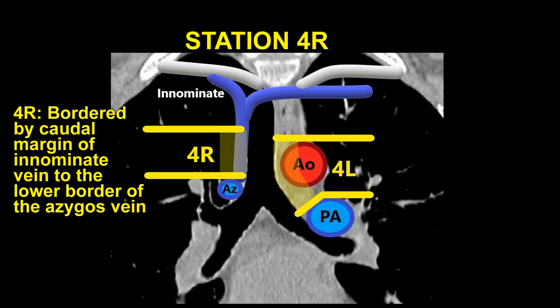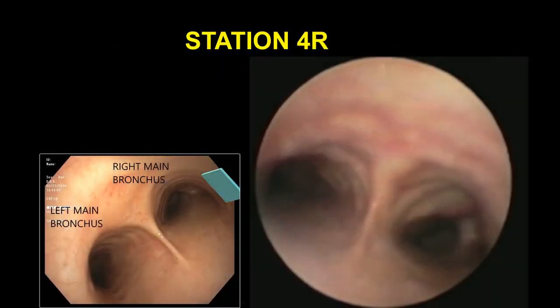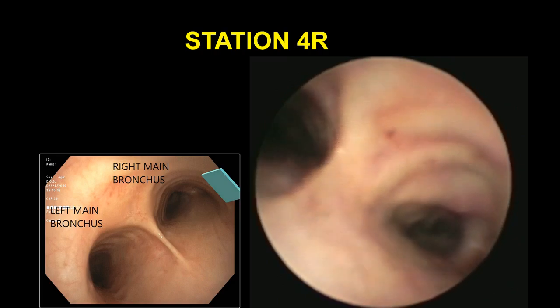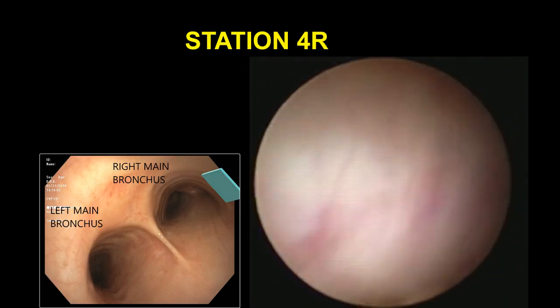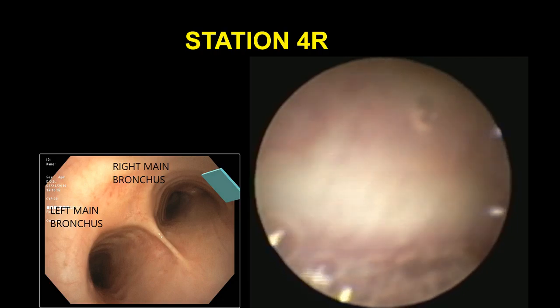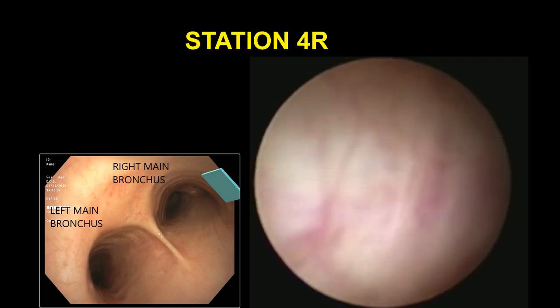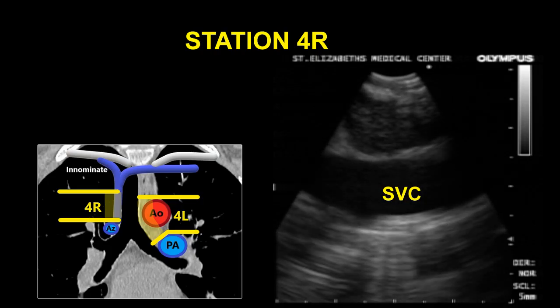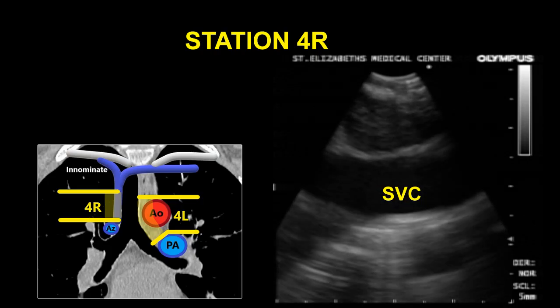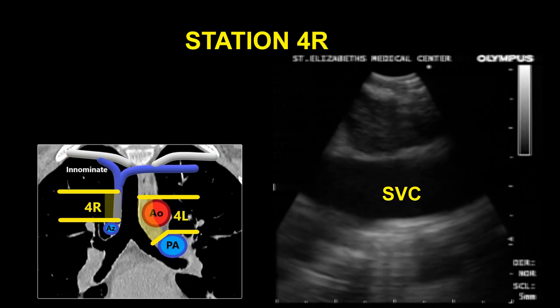Station 4R, the right lower paratracheal region, is bordered by the caudal margin of the innominate vein to the lower border of the azygous vein. To visualize this station, the EBUS scope is placed proximal to the main carina with the probe facing towards the right anterolateral wall of the trachea, scanning from the 3 o'clock position towards the 12 o'clock position in counterclockwise fashion. In this video, the probe is oriented anterolaterally so that the lymph node can be seen superficial to the superior vena cava.